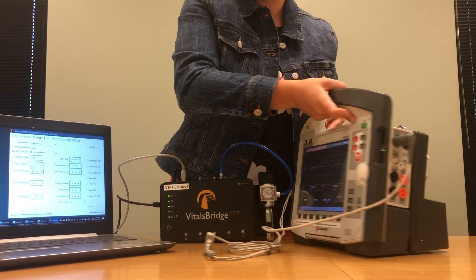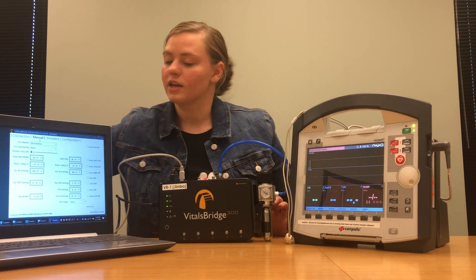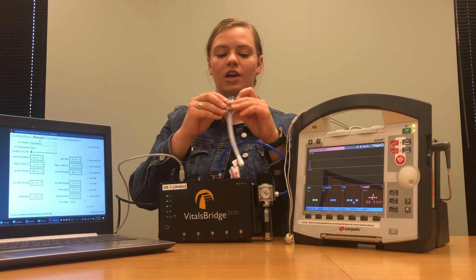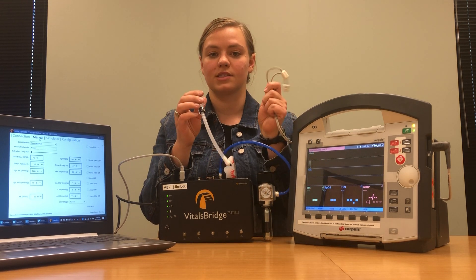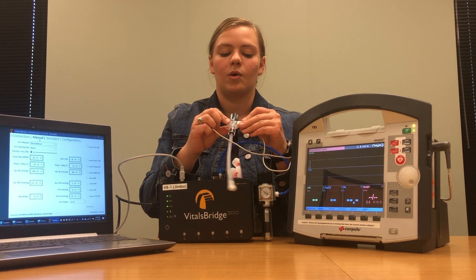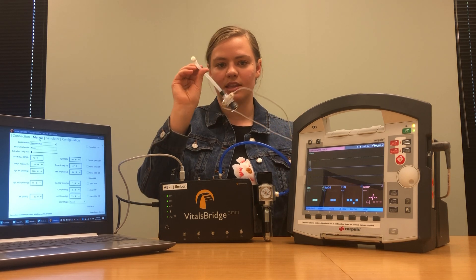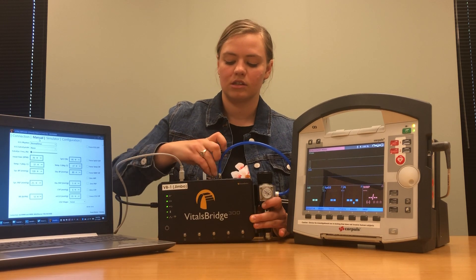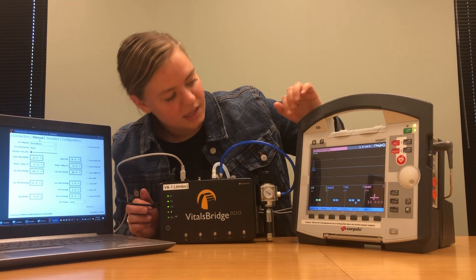Once you have that plugged in, set it aside for a minute. Then take the CO2 adapter that comes with your VitalsBridge — it has triangles on one side and no triangles on the other. Take each of the two little boxes from the cable and match the sides with triangles to the triangles on the adapter; they should snap into place. Then take that adapter end and plug it into the little box that says CO2 out.